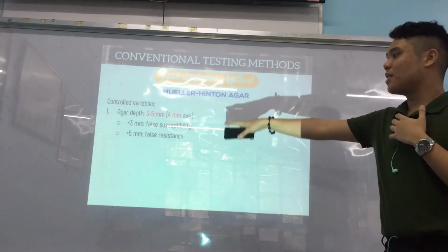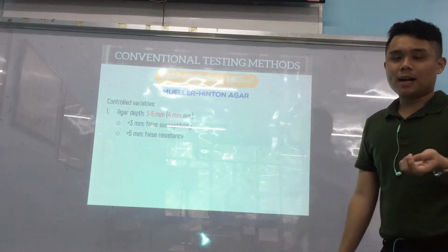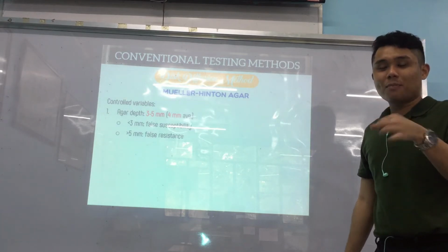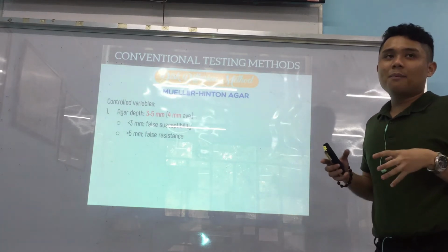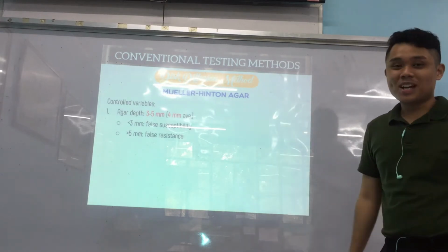Okay? Now if greater than 5, pod baga ra kay mong media, so mas daghang kagaw na pwedeng motubo. So kato mong antibiotic ma-overwhelm, okay? Dili na jud ma-express ihang full power. So pwedeng na ay false resistance.